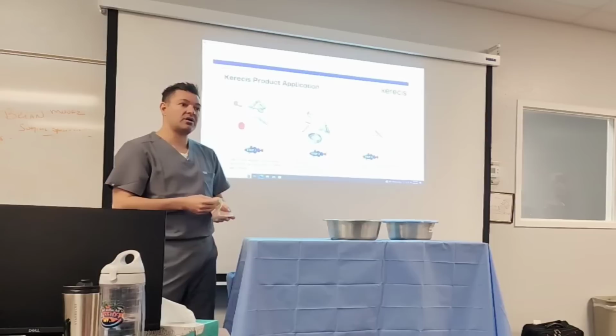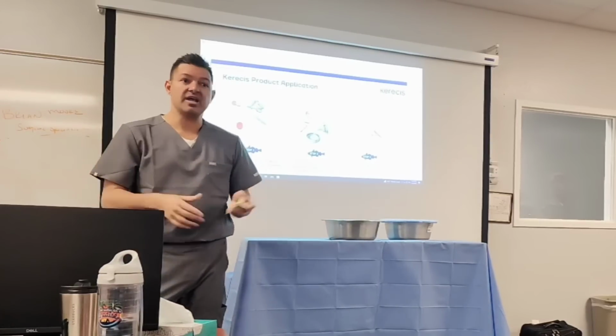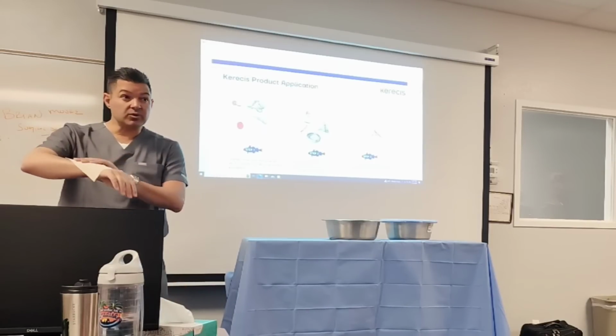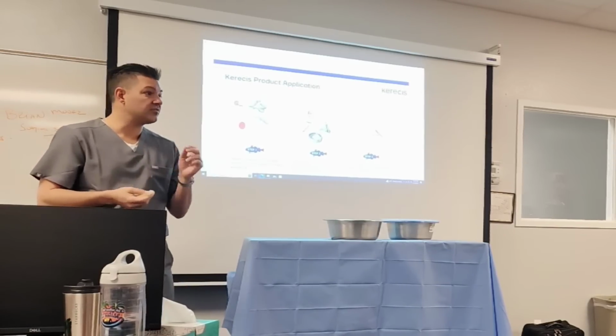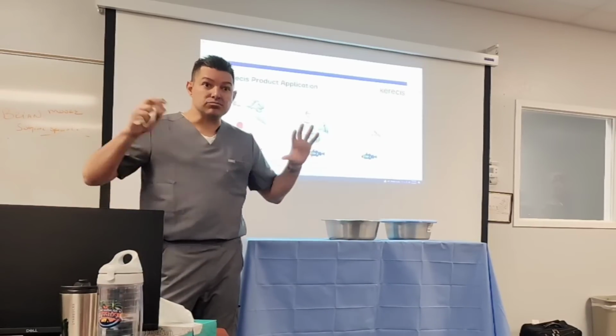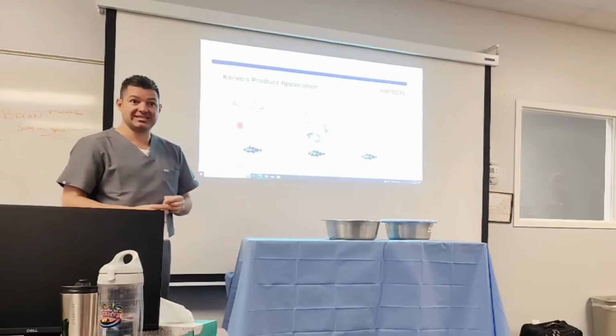And our motto is really that we need to make it bleed to seed. That's the important part. It's not just laying it and saying, okay, you're good to go. So I really want to reiterate that it's very important that we want to have the bleeding. The bleeding is what really creates that seeding. So we want to make it bleed to seed, okay?